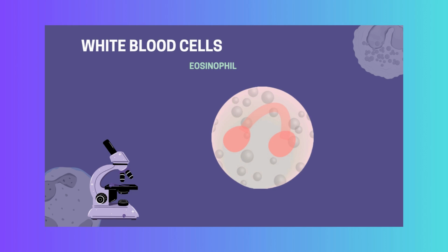Eosinophils are medium in size and also a granulocyte. The granules in an eosinophil are large and bright pink or red when stained. These granules are often so numerous and dense that they can obscure the nucleus.